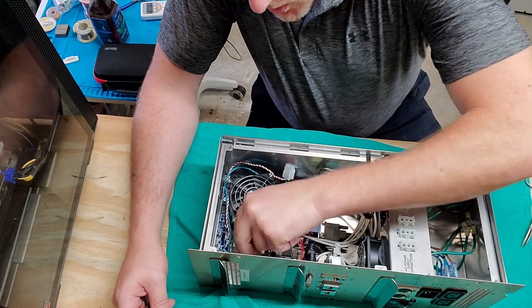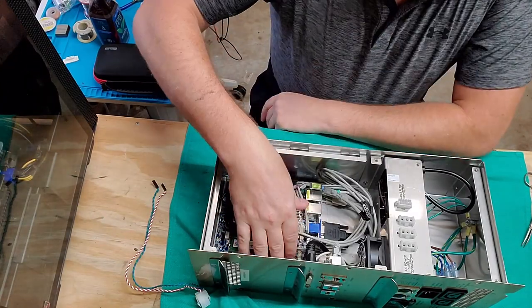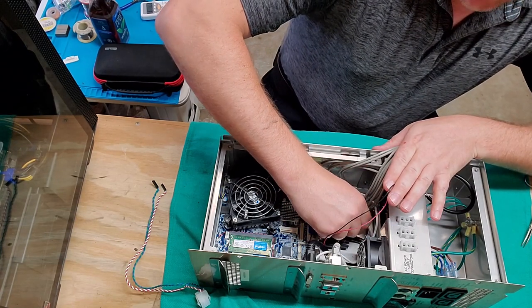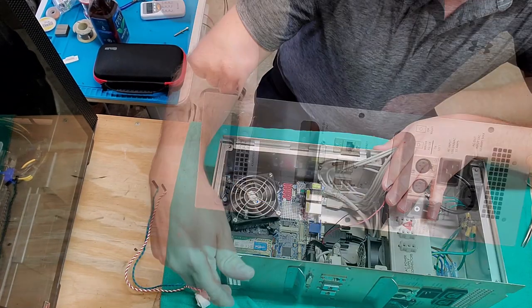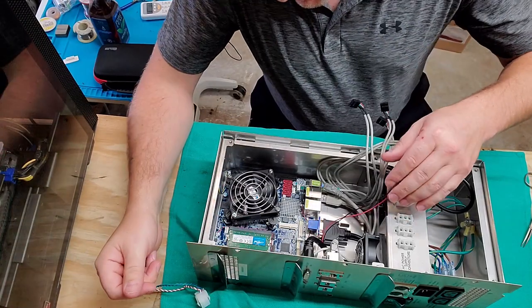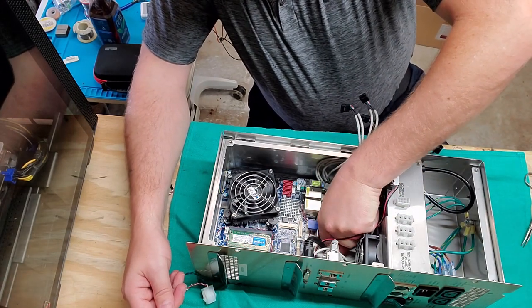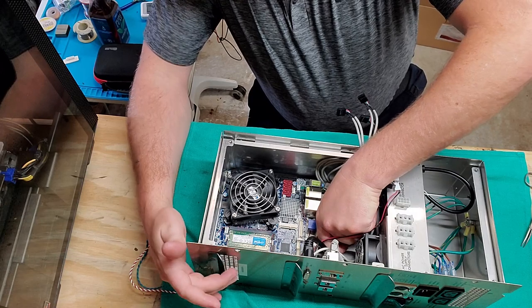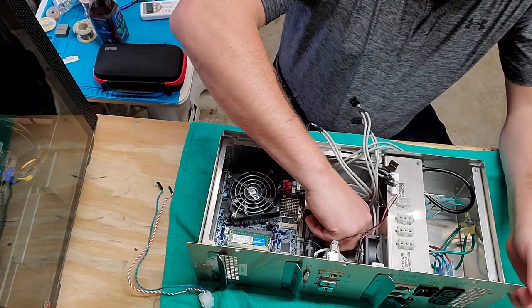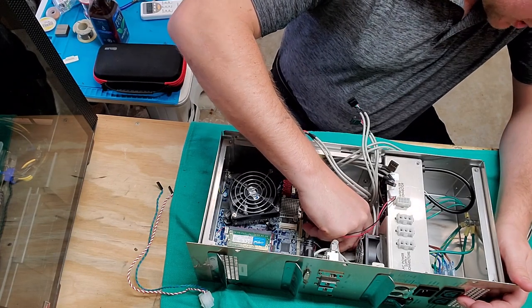So this CPU was changed out already because part of our service agreement with Medivators is that they will come out and change out whatever they need to. Cold air induction port right here on the front. And I can see there's some debris that goes right across the memory modules, and it's got a straight shot right to the CPU cooler. So that's why that guy's getting dirty as well. If they had some sort of filter media right here that you could change during a PM, that would probably preserve some of this. I mean, the fact that I've got dust over everything inside this case is just kind of telling you what's going on.